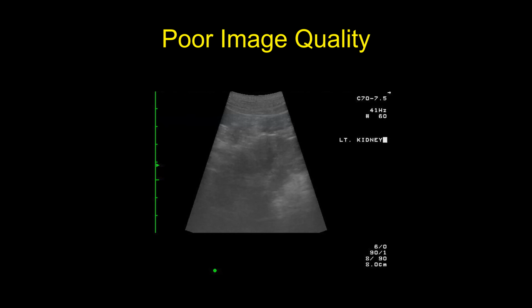So here's an example. So again, ultrasound is a form of cross-sectional imaging, just like CT and MRI is. And it allows us to get slices of whatever plane we have the probe turned at, one slice of a particular organ. Okay, so it's not like a radiograph where we have the whole abdomen and all the organs are kind of smashed on top of each other, and we have to try to see around that.